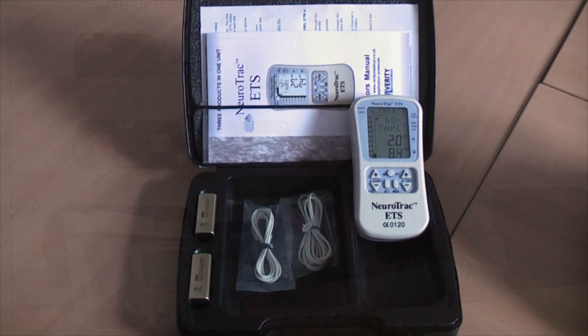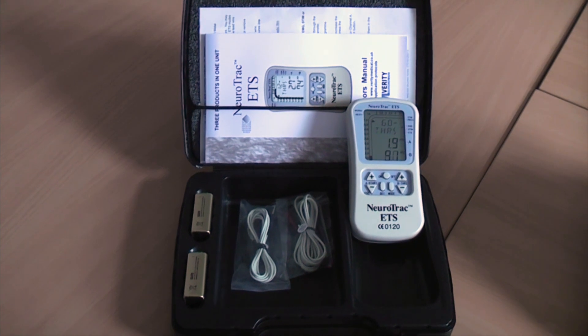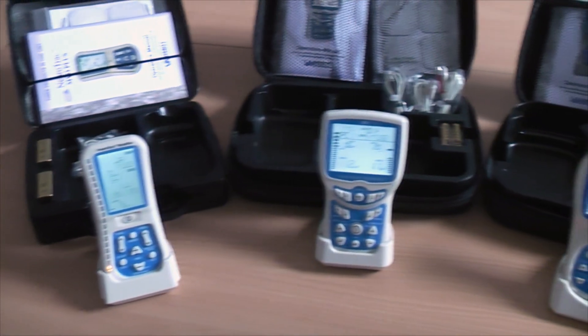Hi there, my name is Peter and I'm here with a new video from Verity Medical to show you some of the exciting features of the Neurotrack Maya Plus II. The Neurotrack ETS is a device that many of you are familiar with, but now it has been superseded by the Maya Plus range of devices: the single channel Maya Plus I, the dual channel Maya Plus II, and the quad channel Maya Plus IV and Maya Plus IVS.